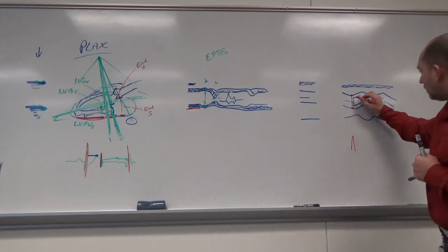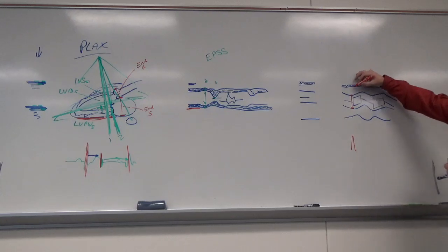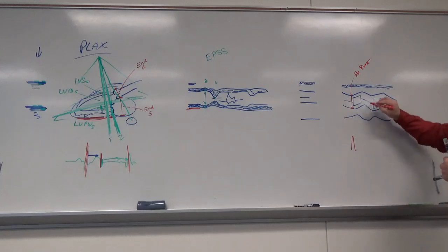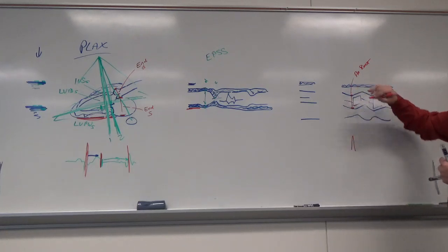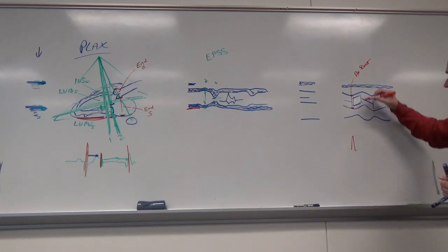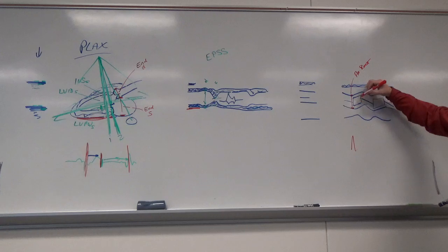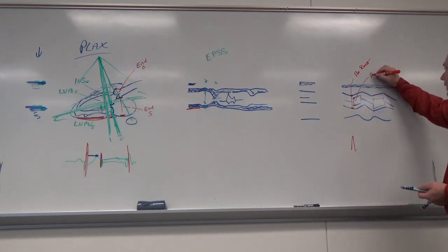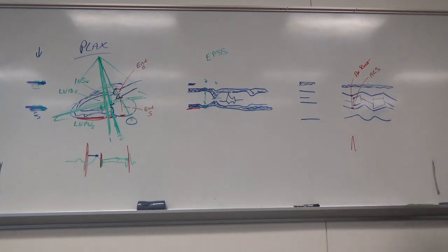Then I'm going to measure the aortic cusp separation. So, aortic root. Next one's going to be cusp separation. This one we do inner to inner because we want to see how far they separated. So this is my right coronary cusp. That's my non-coronary cusp. We do inner right at the beginning of the cycle, and vertical, I want to measure the space that it opens. This tells me if a valve is opening properly or if it's stenotic. So that is what we call ACS, or aortic cusp separation.